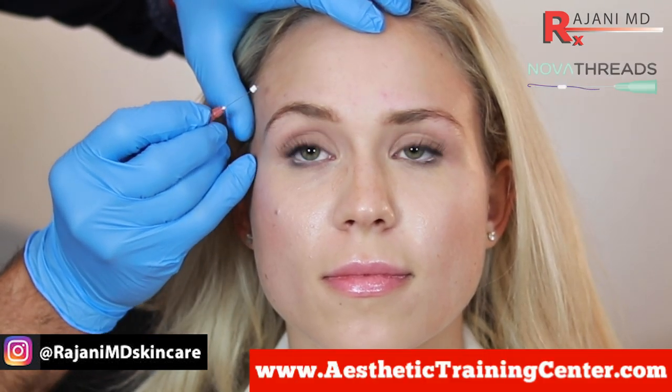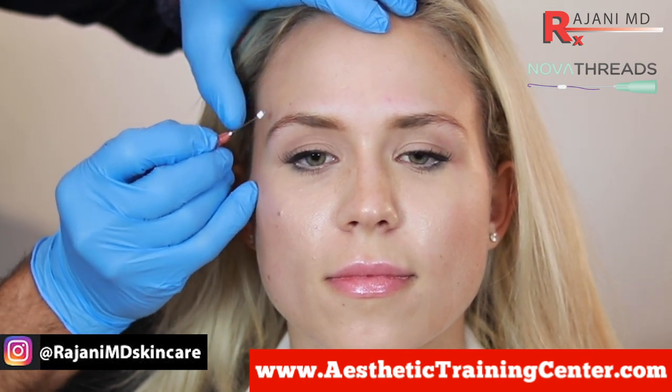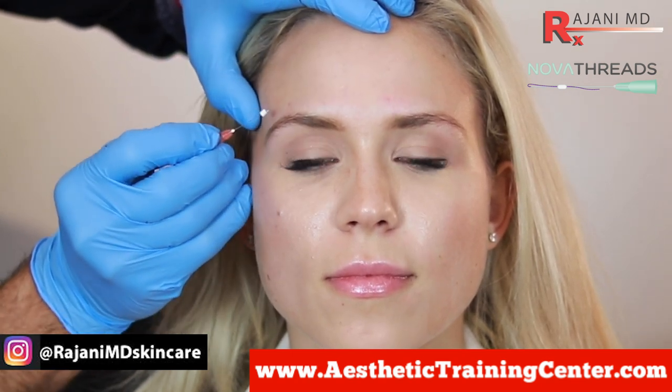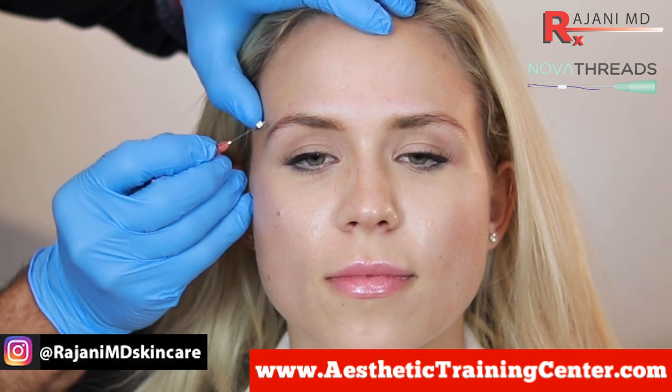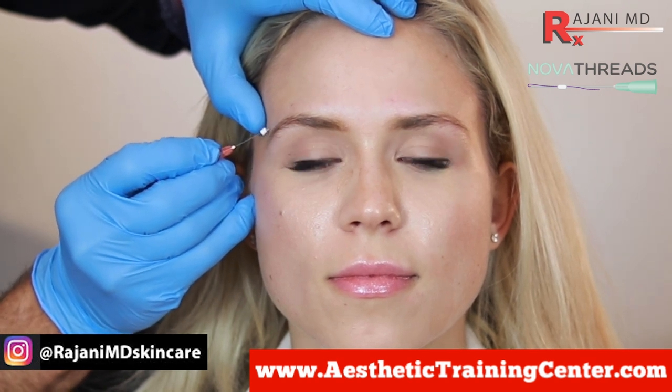So this is the zone. Raise your eyebrows and relax. At the temporal crest, she doesn't have any frontalis, which is really nice because we can neuromodulate the upper forehead and not worry about a droop. However, we're looking ahead and we want to create a little bit of volume, but also collagen, so we never have to use neuromodulator in this zone.